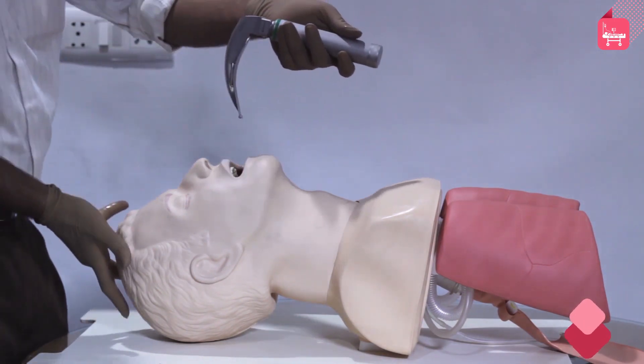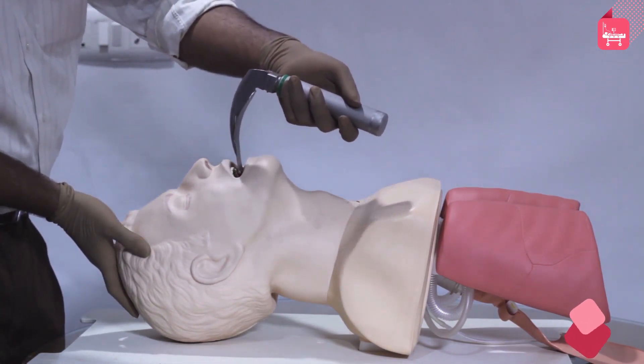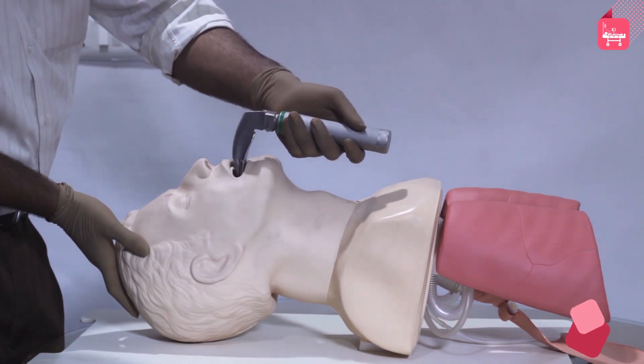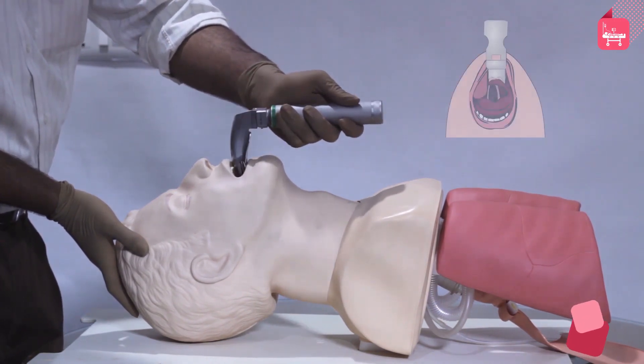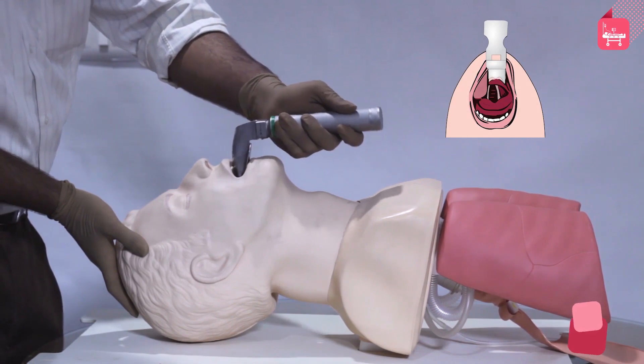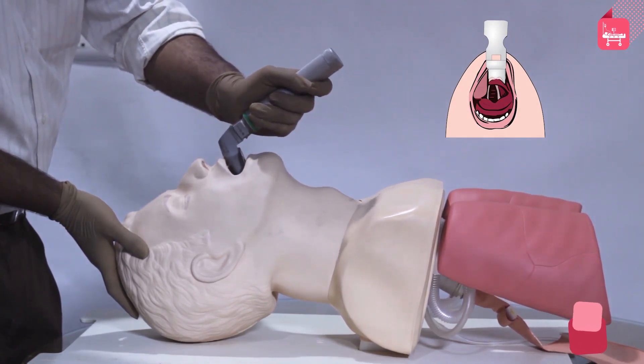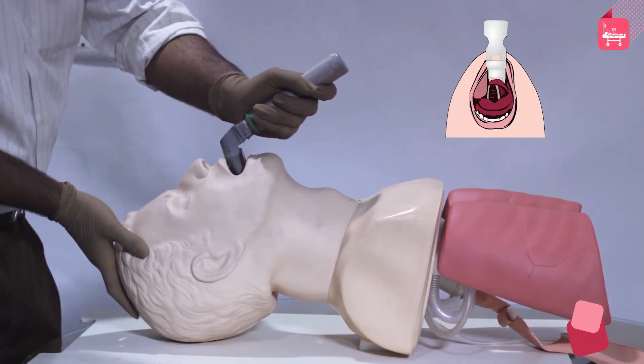Hold a laryngoscope in the left hand and introduce the blade of the laryngoscope carefully into the right side of the mouth, avoiding contact with the teeth and lips. Advance the laryngoscope towards the right tonsillar pillar. Once the right tonsillar fossa is visualized, move the blade to the midline, sweeping the tongue left.